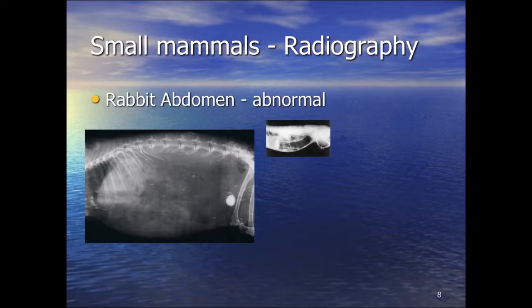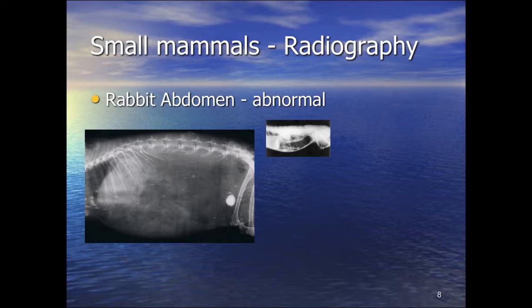This particularly large viscous structure down here is the cecum — we can see the haustrae, the actual chambers of the cecum, and they're just full of gas. This is typical when you get clostridiosis or severe enteric disease associated with things like E. coli or salmonellosis. We've got a tympanic rabbit — it shows up really well on radiography. There's very little ingesta in there and we've actually got gas in the small intestine as well, and gas in the stomach. When you see that particular haustrated organ, it's almost certainly going to be cecum and possibly proximal colon.